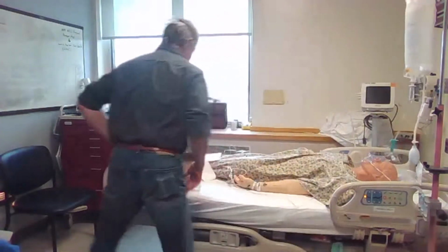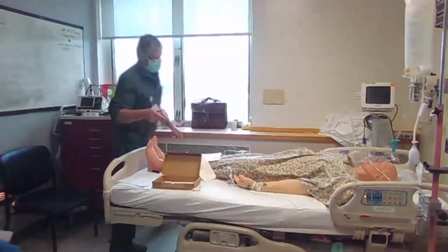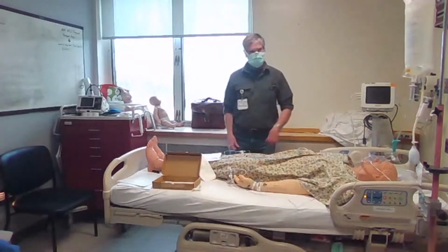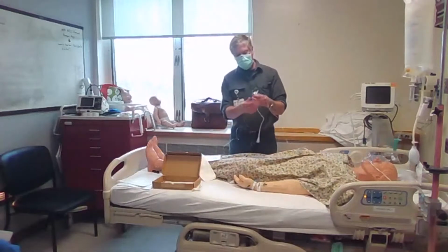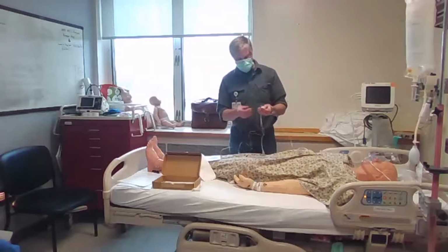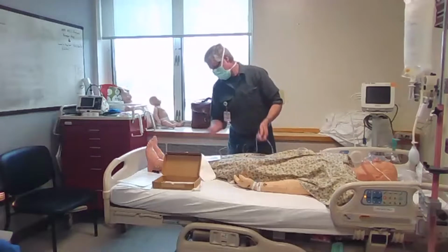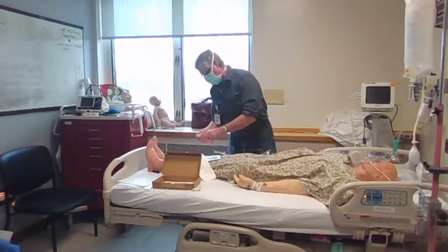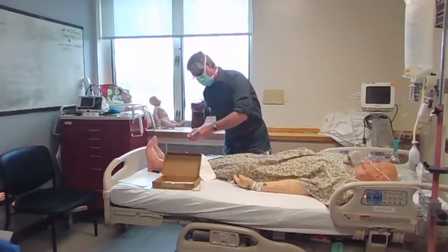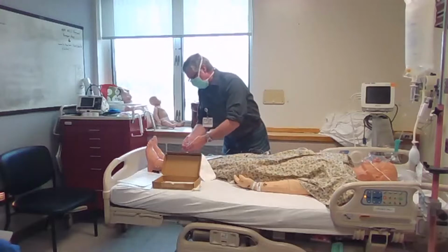Goodness gracious. So that's just the easy way to do it if you turn the stopcocks correctly. So this is the flush. And once you've done that with the stopcocks, you've got different color ones that are yellow. Because obviously once you hook it up to the patient, you want to keep it sterile. This is supposed to be as sterile a procedure as you can.